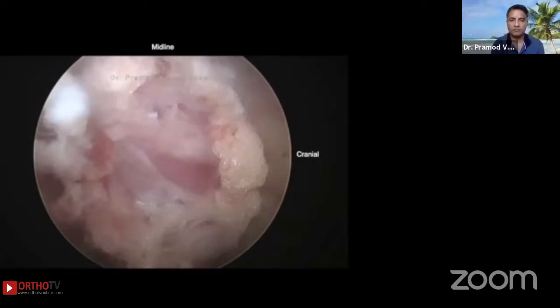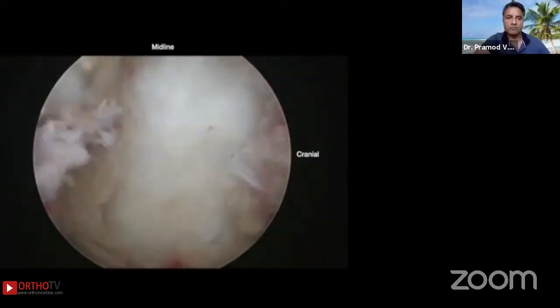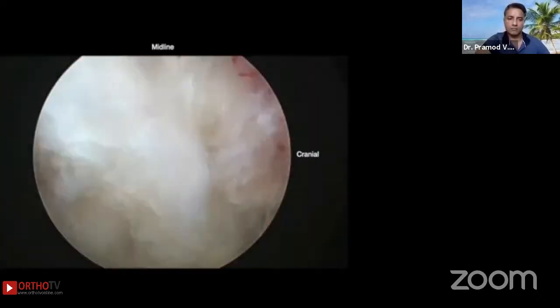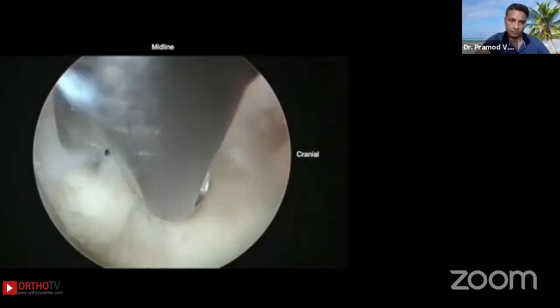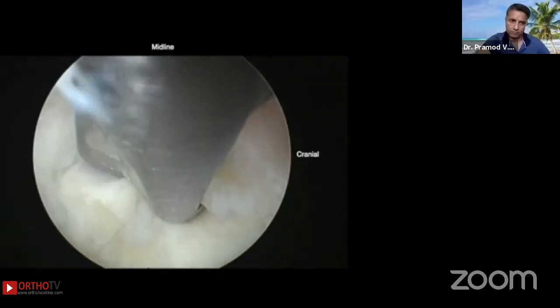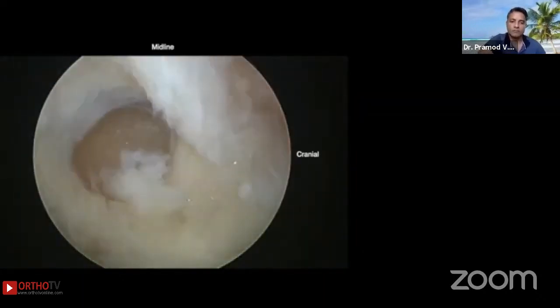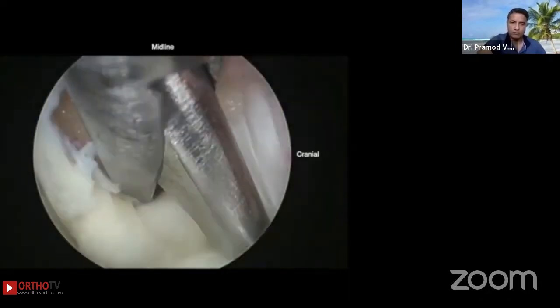Now coming to the actual surgical procedure, the endoscope is then inserted through the working channel, and this is the first vision. We see some muscle and adipose tissue which is removed with the help of forceps to expose the ligamentum flavum. We start cutting the flavum near the midline layer by layer till the epidural space is opened, and the tip of the cannula is used to stretch the ligamentum flavum so that it becomes taut and the cutting becomes easier. And once the space is opened, we start cutting the flavum laterally till we reach the facet joint.